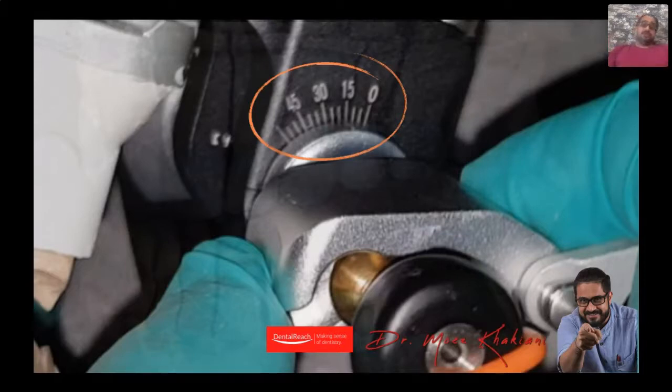Now I know there's a question in your minds. Okay, I've understood H value is important. Now how do I record the H value? The simplest way to record an H value is to have the patient bite in an edge to edge position and then record the amount of separation at the back with the help of a bite registration wax. This is your alu wax. I love to use Bital. I will show you what Bital is as we move forward through this presentation.